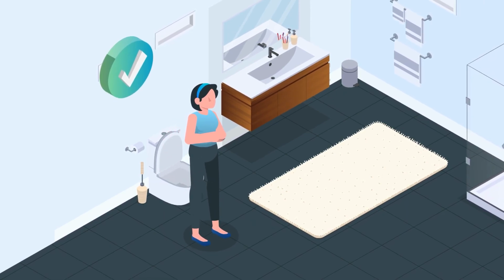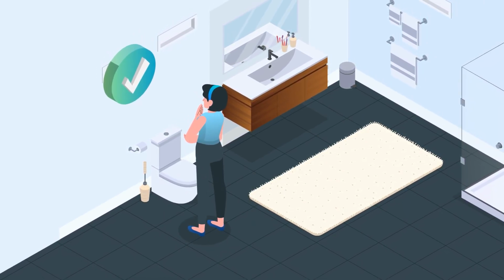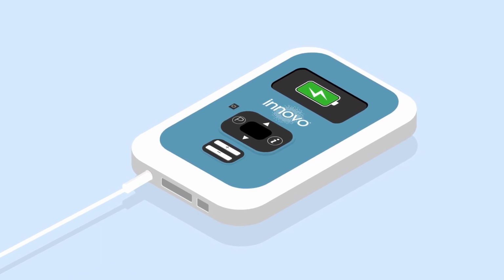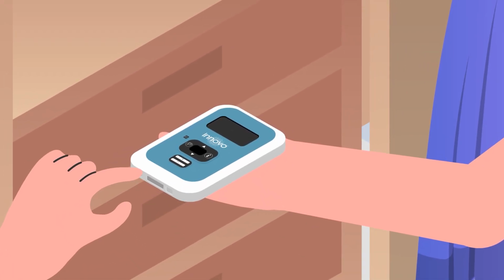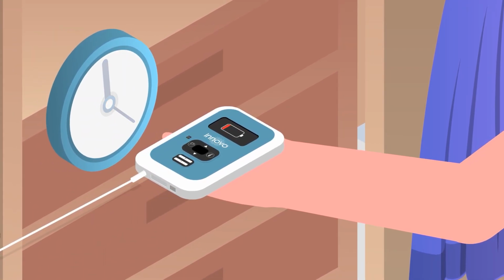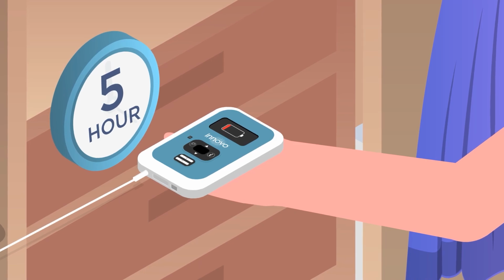Prior to treatment, always use the restroom and empty your bladder. Before you start using INNOVO, please ensure the battery is charged. Slide doors to closed position, then insert charger into port. Once the battery is fully drained, it will take 5 hours to fully charge.